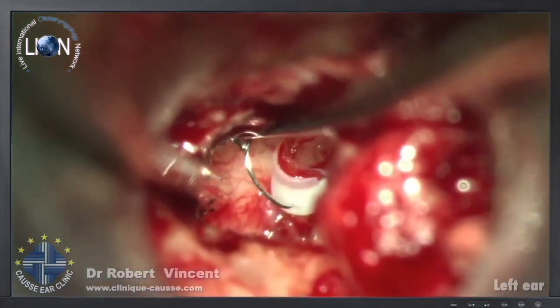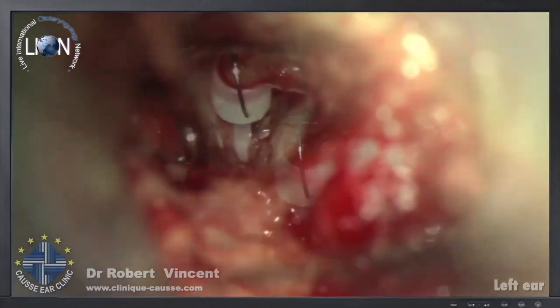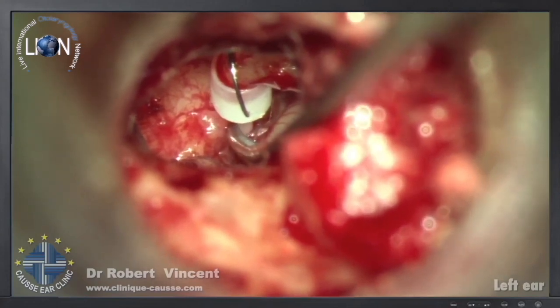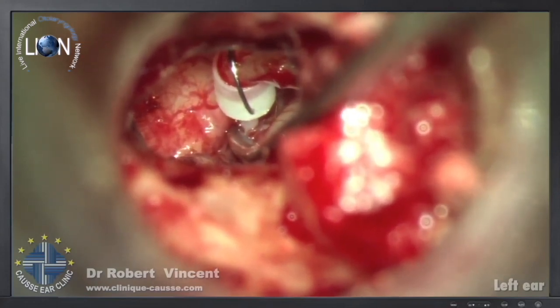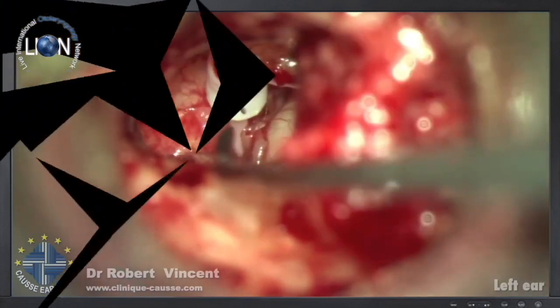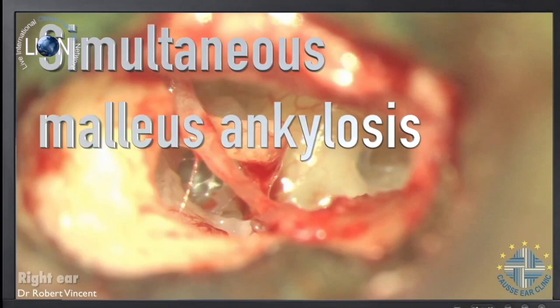And then I will put this wire loop over the incus to try to increase prosthesis stability, I mean long term. And then again, always looking for the bending sign. The piston or prosthesis should bend like this, but not move away from the oval window. Now, this is a nice precision case of short incus or dehiscent facial nerve.